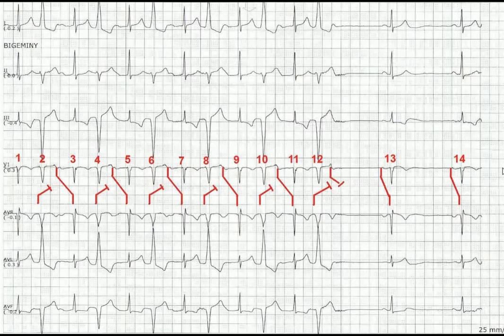What about the blocked P wave — the non-conducted P wave after QRS number 12? That P wave reaches the AV node during its absolute refractory period. It is in the absolute refractory period because of the concealed retrograde conduction of the PVCs, and hence this P wave fails to conduct.